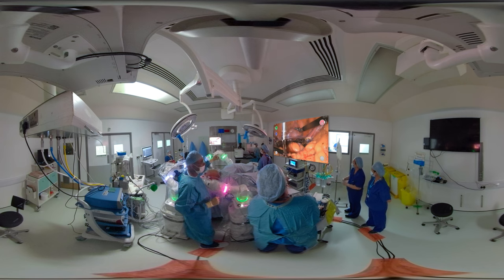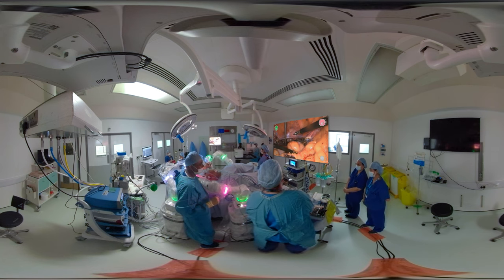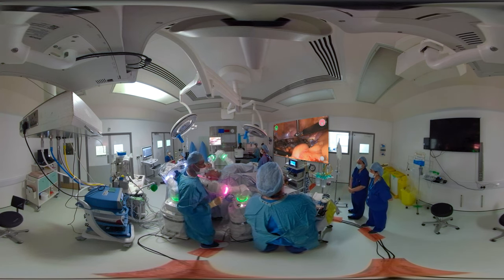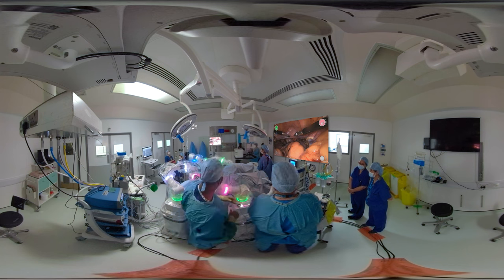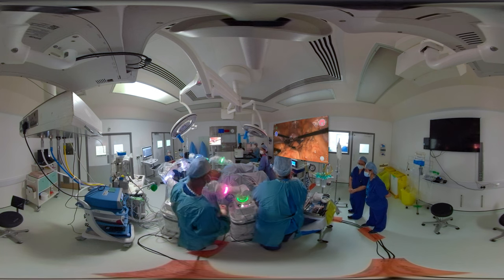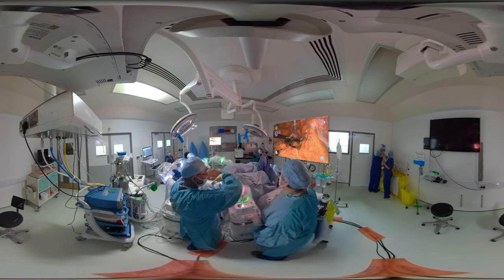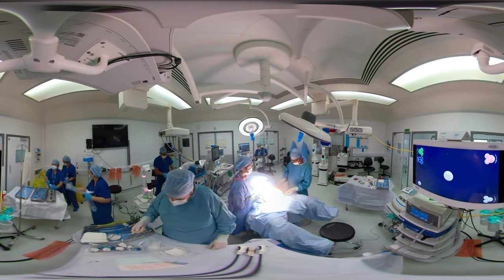I'm just going to do a bit of irrigation there to make sure there's no bleeding. I prefer to deflate the abdominal cavity for about five to six minutes and then ensure that the systolic blood pressure is up to at least 100 millimeters of mercury before I close. Here you can see good hemostasis with no active bleeding. I'm going to straighten all my instruments and my colleague standing by the patient's bedside is then going to remove each instrument on each of the instrument arms under vision. He is now removing the needle holder on the patient's right hand side, and I'm suturing the skin — and that's the end of the surgery. Thank you very much for watching.